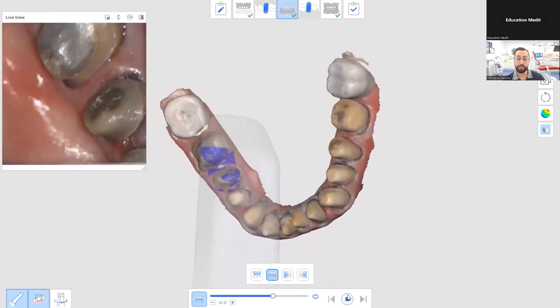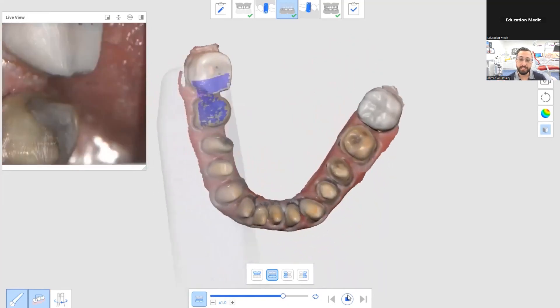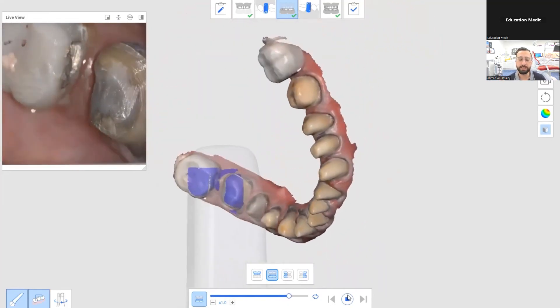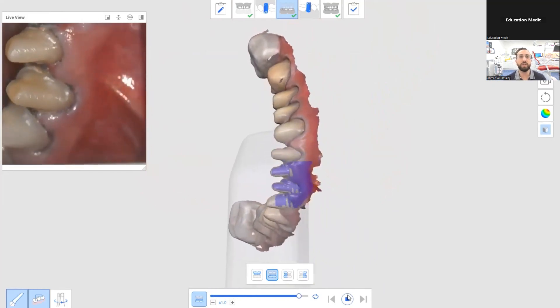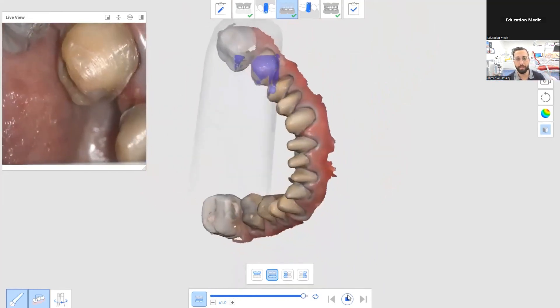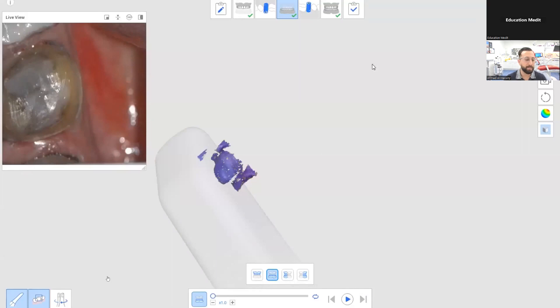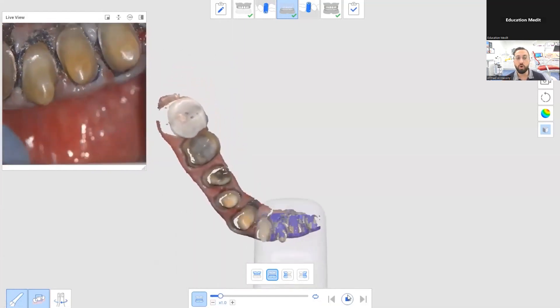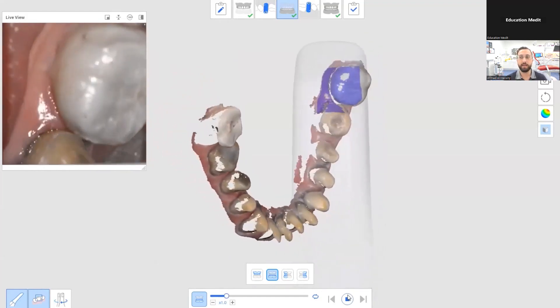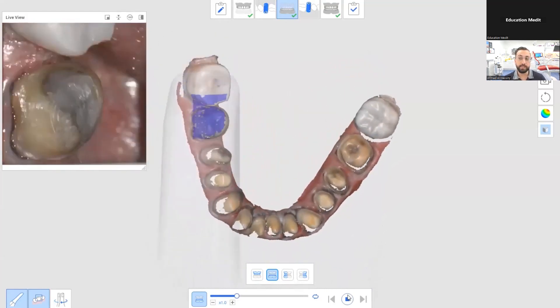Every single tooth preparation has retraction cord. The beautiful thing about scanning is that taking a traditional impression of this is exceptionally difficult — you have to pull out each retraction cord, put light body into each preparation, and hope there are no air bubbles, because if there are, you're in a world of hurt. With scanning, if there's any area where there's bleeding over the preparation or the tissue isn't quite retracted perfectly, you can easily go back, clear that area, and re-scan.